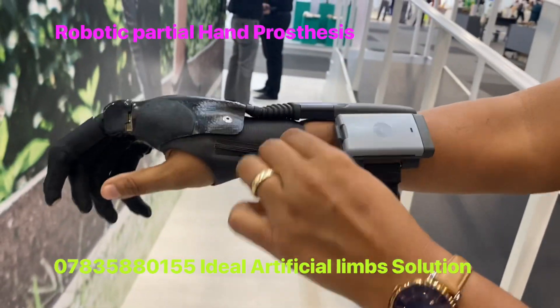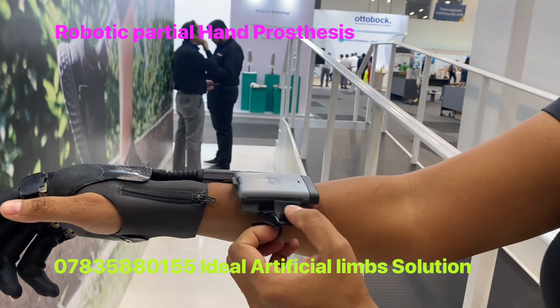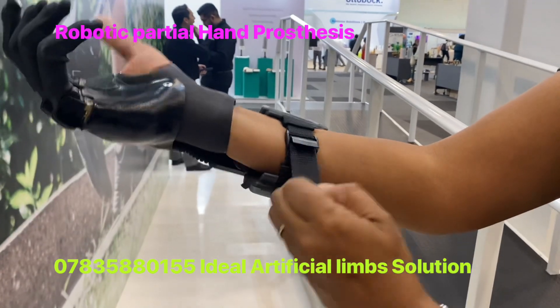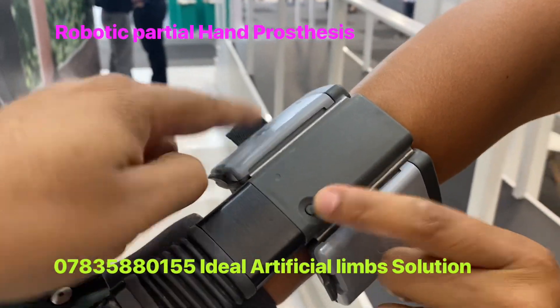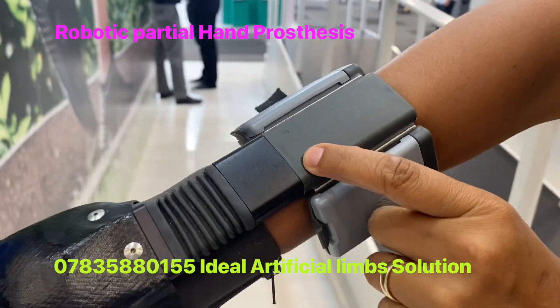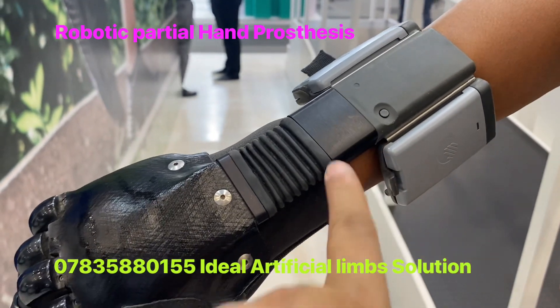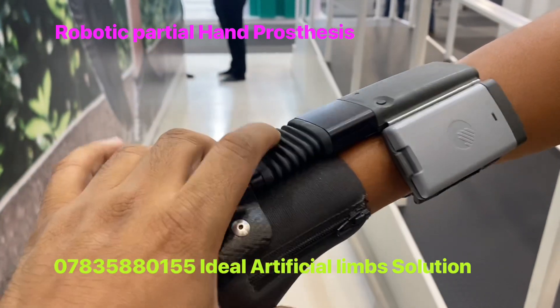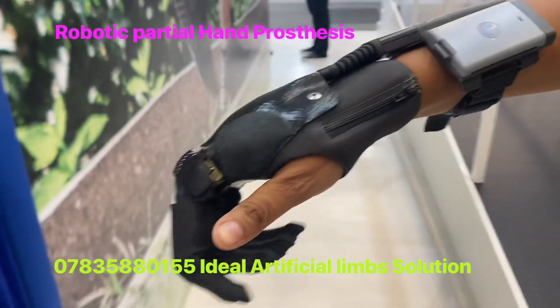There is a band — an arm band. There are two batteries here. This is the on/off switch. The processor is over here. And this flexible band provides wrist movement.